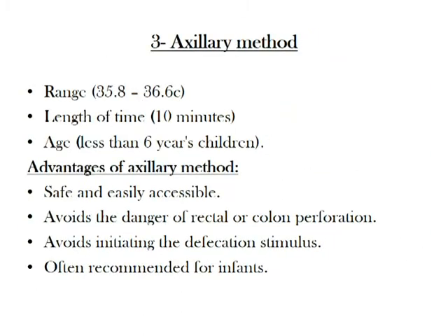Axillary method: range 35.8 to 36.6, length of time 10 minutes, for children less than 6 years. Advantages of axillary method: safe and easily accessible, avoids the danger of rectal or colon perforation, avoids initiating the defecation stimulus, often recommended for infants.